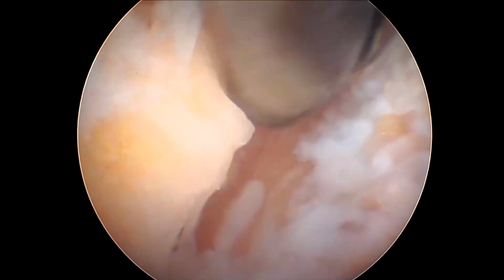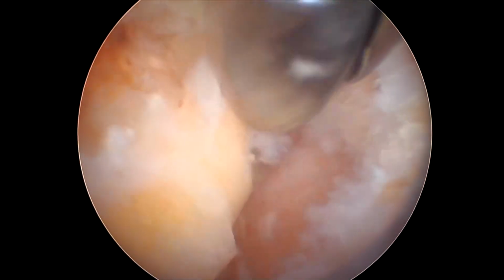Then the message to take home is the following. To remove osteophyte is easy and safe when we remove the osteophyte from cranial to the caudal direction. This process does not take more than 1 minute, and the biggest advantage is that by performing it in this way, you have less possibilities to get a disorientation during the surgery.